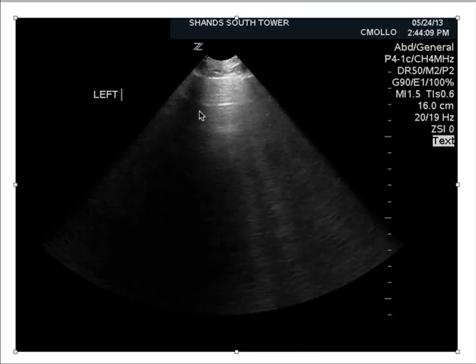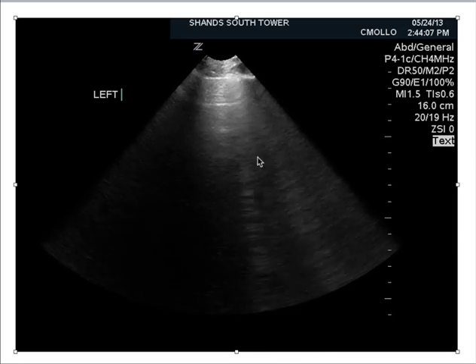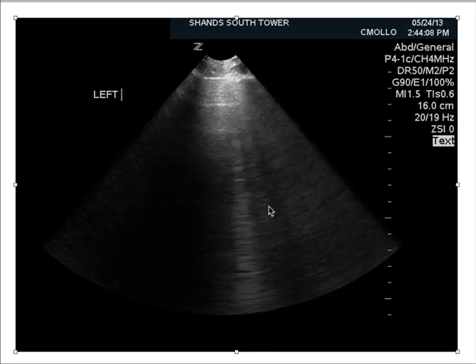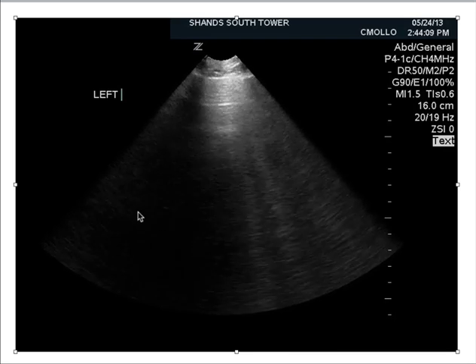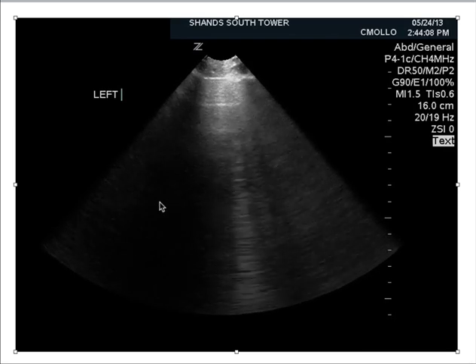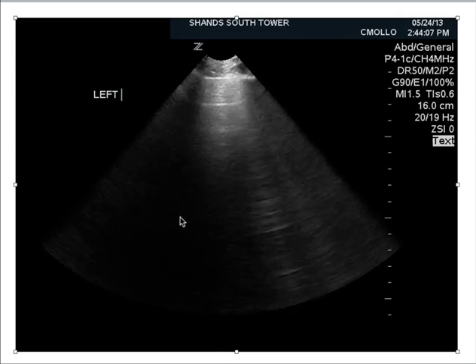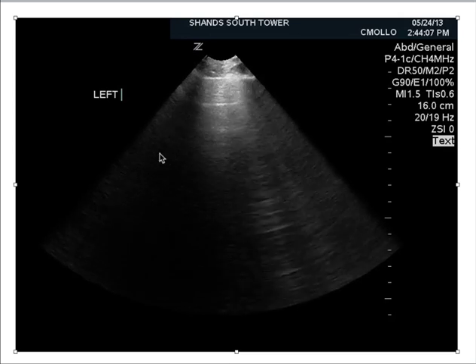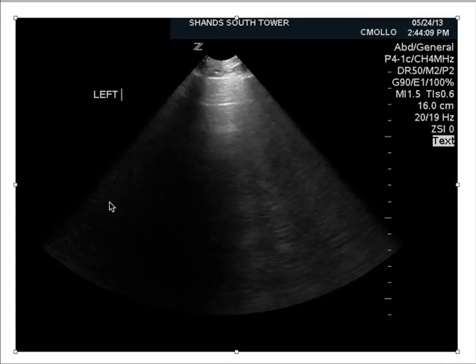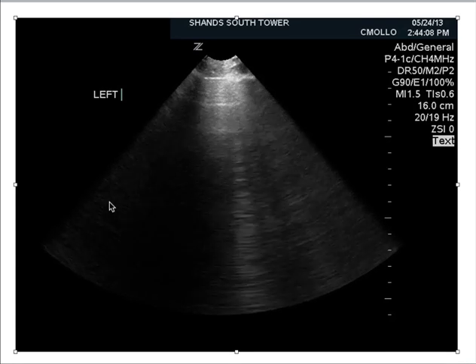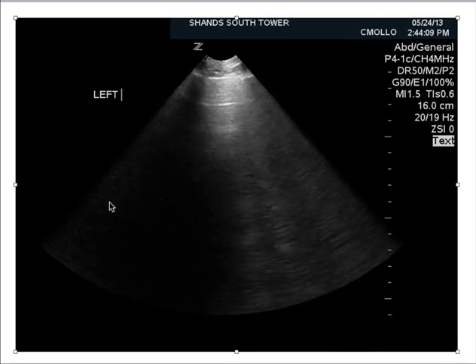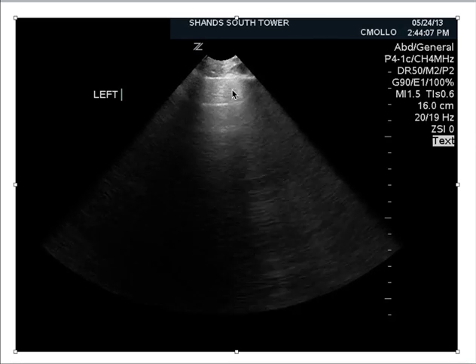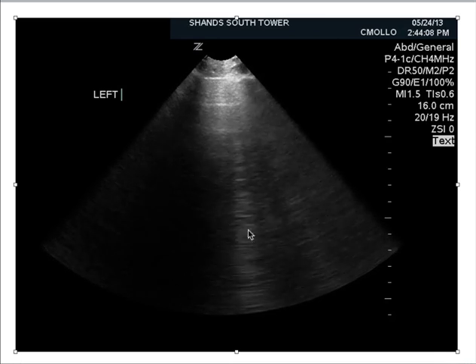Here's some A lines and B lines. In some literature it says you can't have both, but in my experience I've seen some with aspiration pneumonia, especially early in the process — when you do the lung ultrasound right after putting them on CPAP or right after they've come up from a floor setting. You can see A lines, and then as the patient breathes, you can see some B lines coming into the picture.